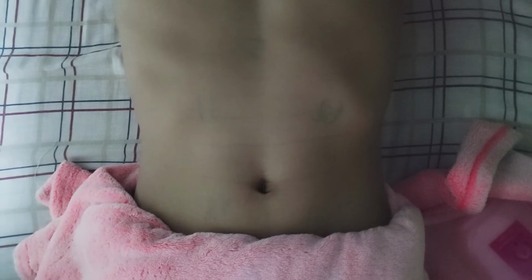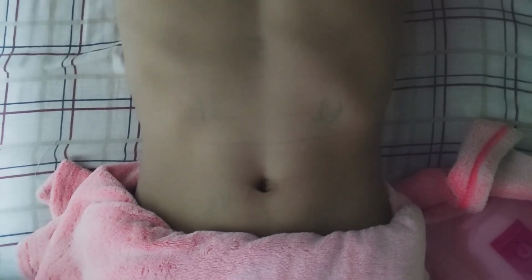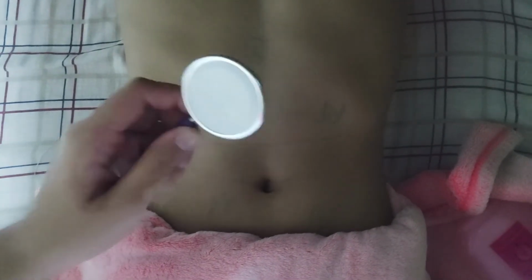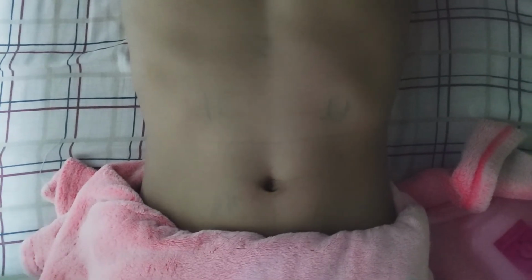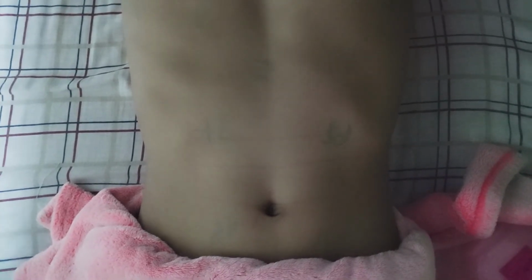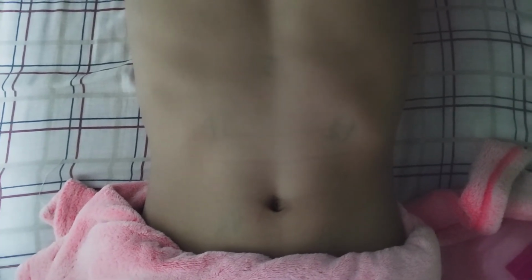Now, we're ready to check the bowel sounds. What we're gonna do is to listen at the diaphragm of the stethoscope and start at the right lower quadrant and work away clockwise, and we will listen to all 4 quadrants, and we should hear 5 to 30 sounds per minute. And if you don't hear any bowel sounds, you need to listen for 5 full minutes. Note if it's normal, hyperactive, and hypoactive.